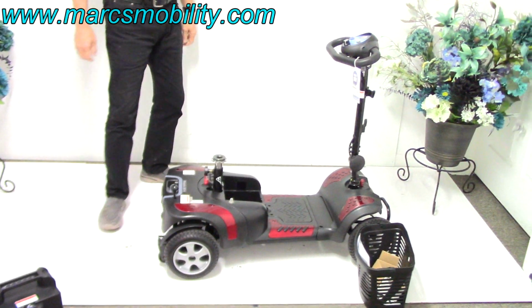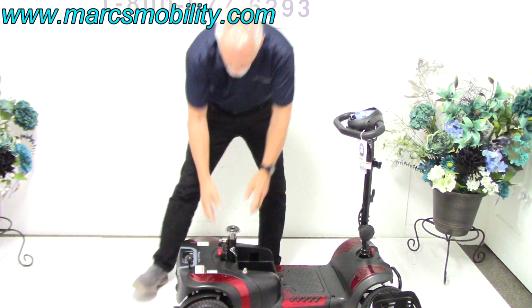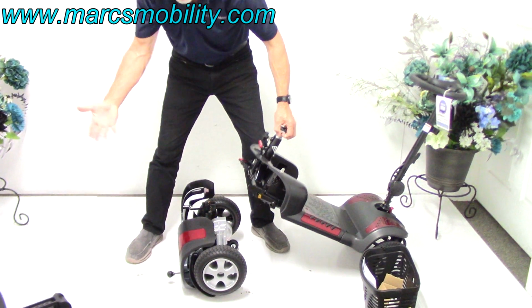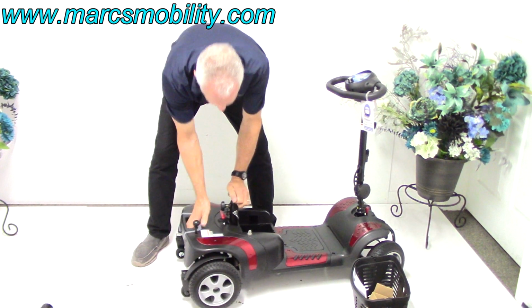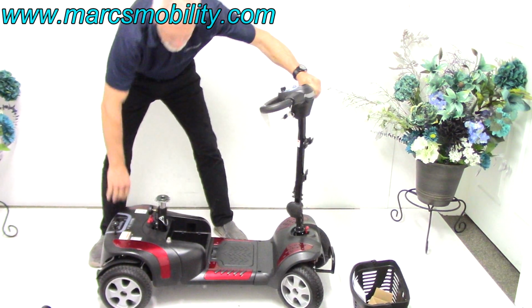That's it. So they have to be lined up. If they're not lined up, it's not going to lock. So again, I'm going to do it again. Okay? If you pull up, it falls on its back by itself. Make sure it's lined up in here properly. And then bring it back, and it locks automatically. I'm going to pull it back here.